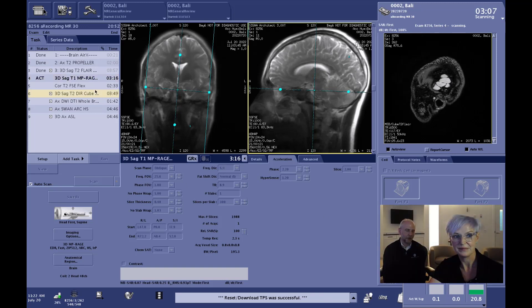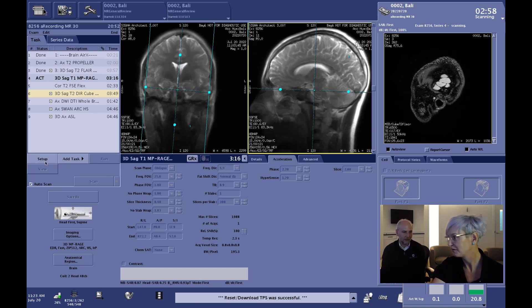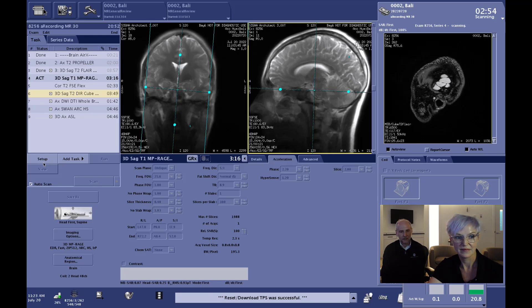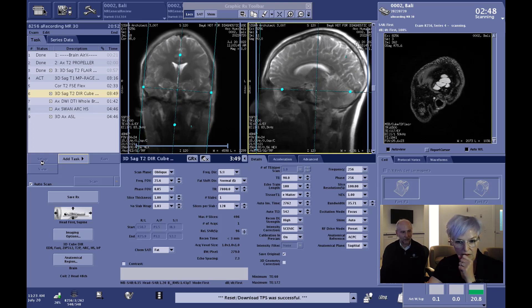Typically, if you were to do this without Air Recon DL, you are not going to be accelerating as much, and you are not going to be doing this resolution either. Scan times would easily be four and a half to five minutes with this particular acquisition. So there is a huge benefit here in using this in regard to workflow and productivity, while also getting better images.